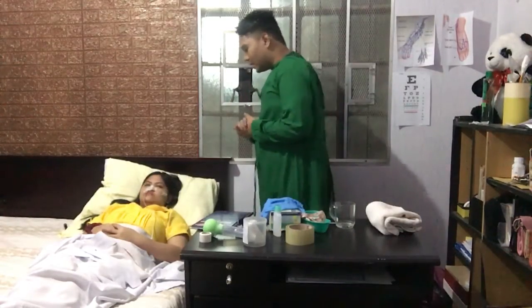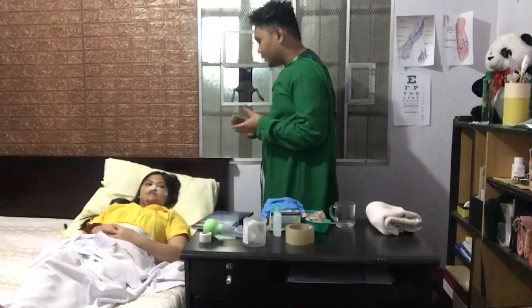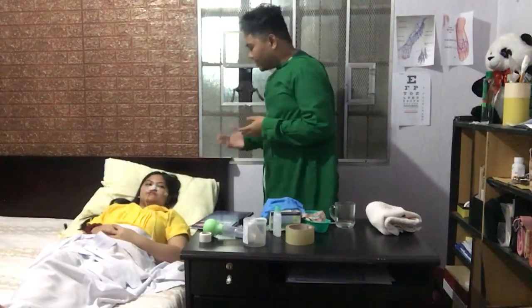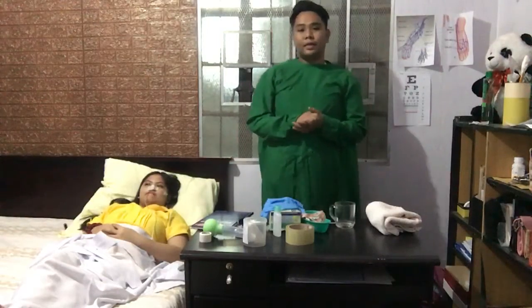Hello po, my name is Angelo Dagdagan from Wesleyan University, Philippines po, and I am your nurse for today, ma'am. Ma'am, may I know your name po? Kate. So, you're Kate po. So, after identifying the patient po, explain po natin sa kanya yung procedure, why is it necessary, and how she can coordinate with the procedure.